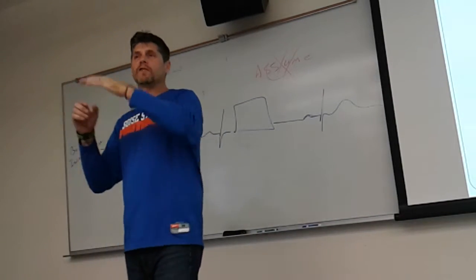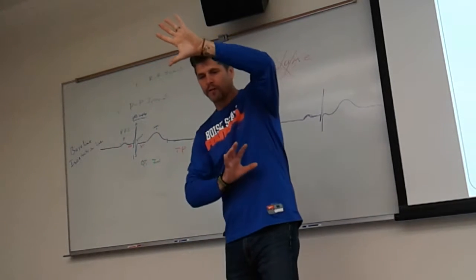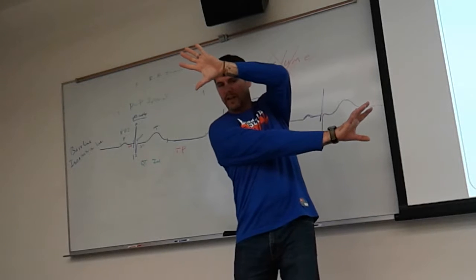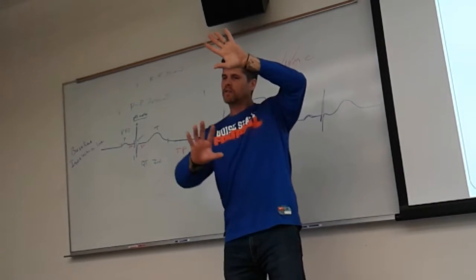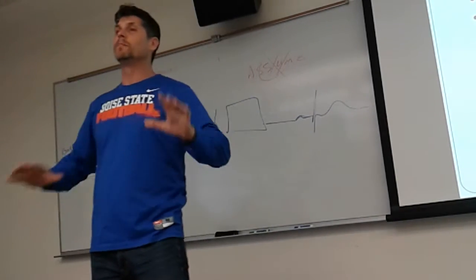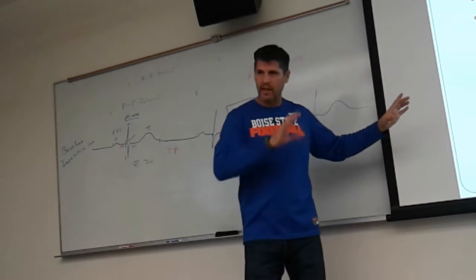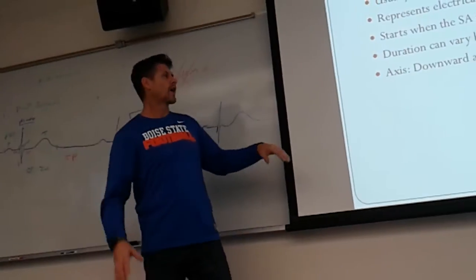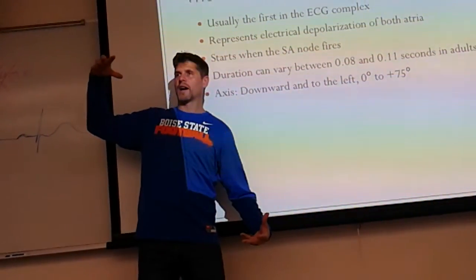Okay, so in the heart, you have waves that are going all over the place. You have some waves that are coming from these cells down to these cells, some that are going from these cells over to these cells, because of gap junctions, yes. Some that are coming from these cells, slightly up to these cells. But the overwhelming majority of the cells in the P wave are coming from a top right to bottom left direction.